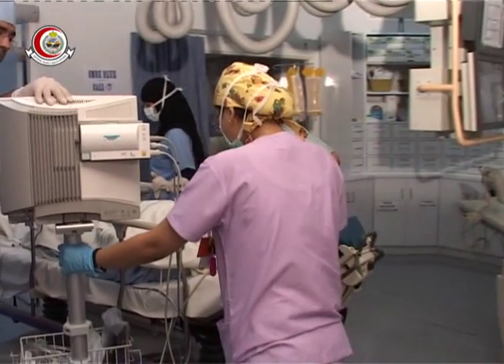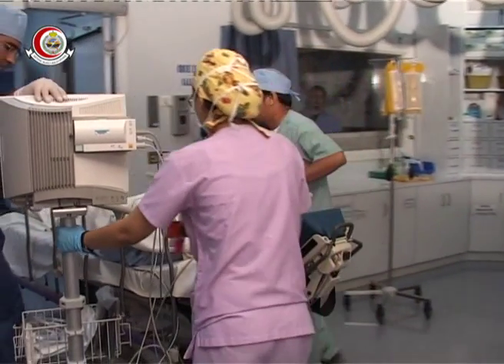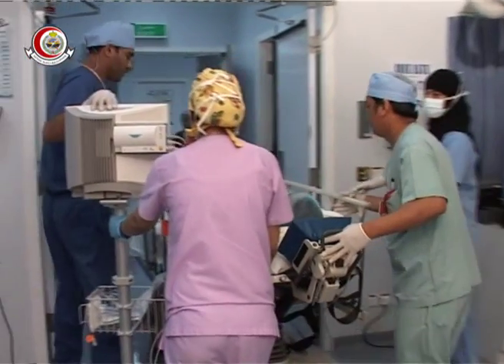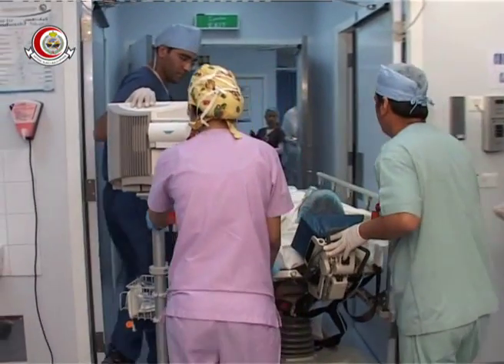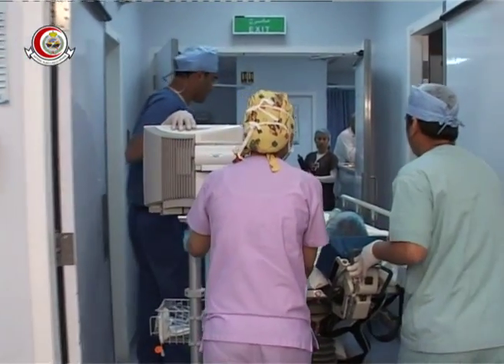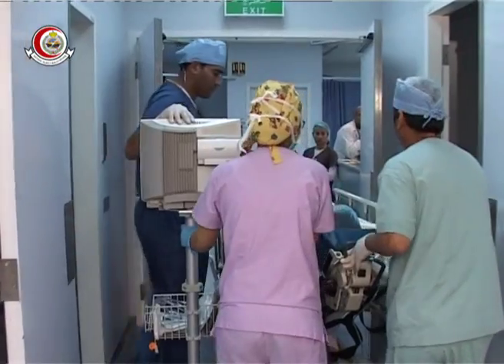The procedure has been completed and the patient will be transferred to the neuro ICU by the angionurse and the anesthesia team.